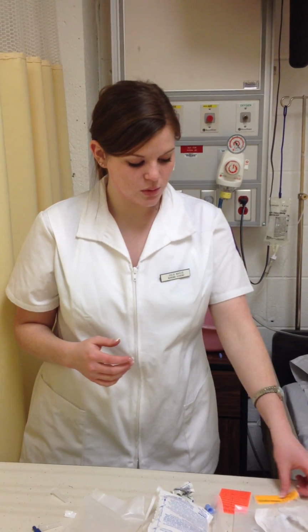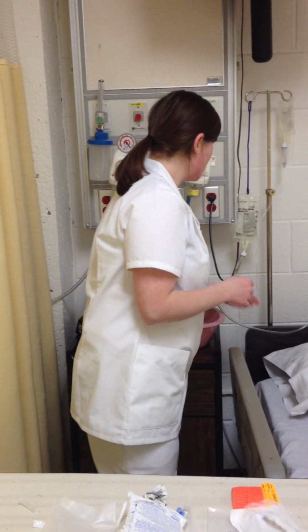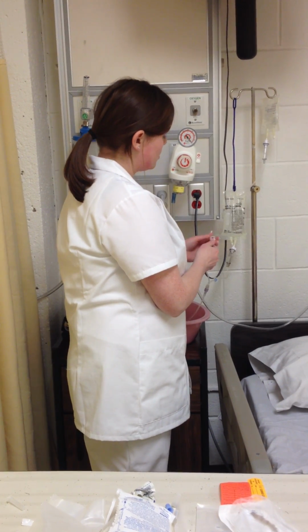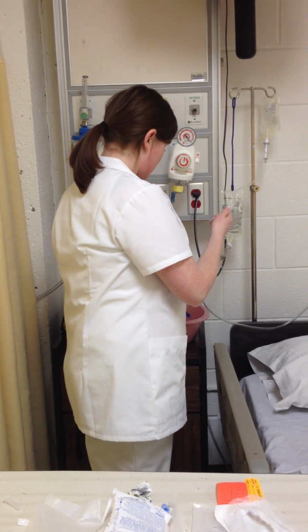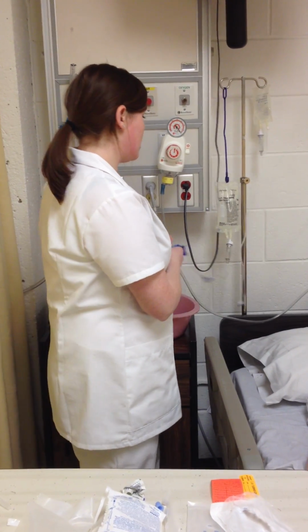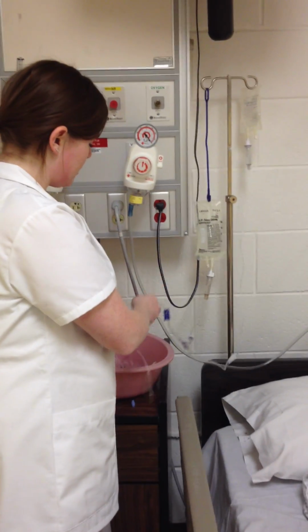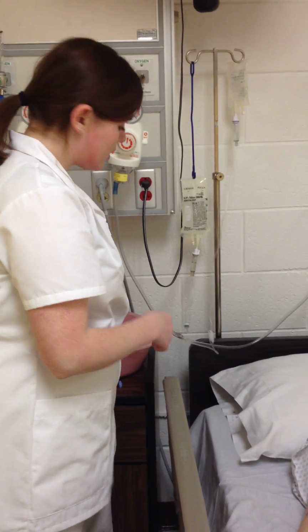Before I leave, I'm going to wrap this around the tubing for the tubing change. And I'm also going to add a medication added sticker to the primary tubing. Then, after a half hour, I'm going to come back and close this. And then I have to recalibrate the primary tubing back to where it's 15 drops per minute. And then I'm going to change the patient's gown.